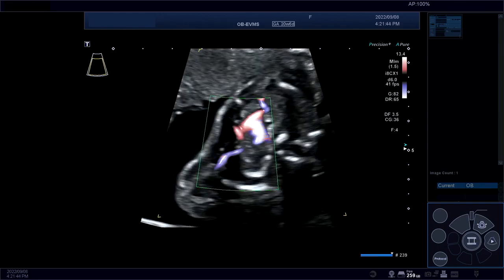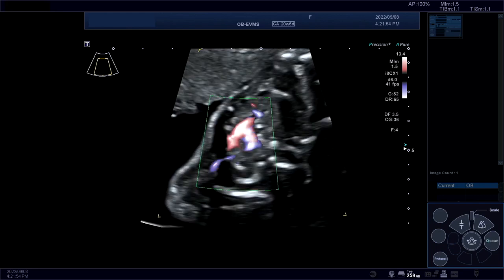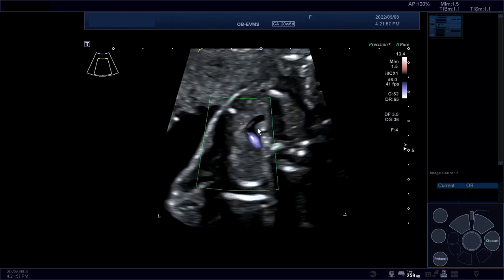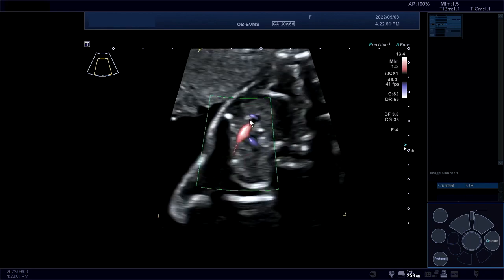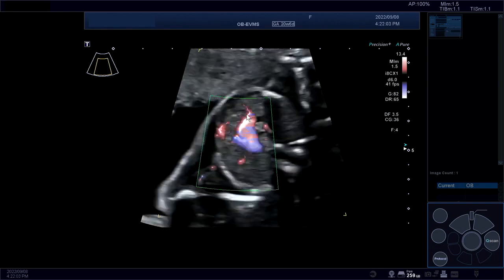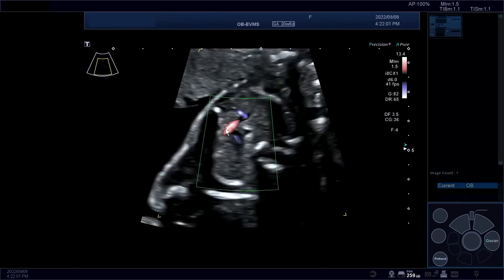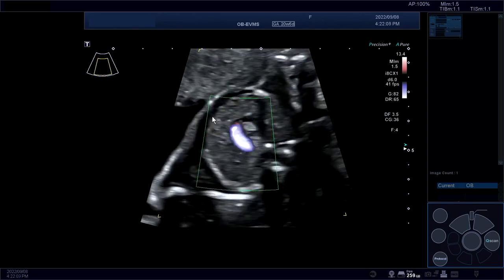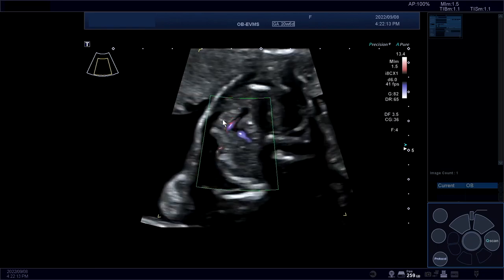I'm talking about the brachiocephalic vein, and here's your brachiocephalic vein dumping into the superior vena cava. Brachiocephalic vein and a portion of the aortic isthmus right here. And this is the thymus gland right behind the brachiocephalic vein. Typically it runs at the outer border, sometimes intrathymic in less than 1% of cases. Here are the mammary arteries that you see on each side that border the thymus gland. They're good markers of where the thymus gland should be.